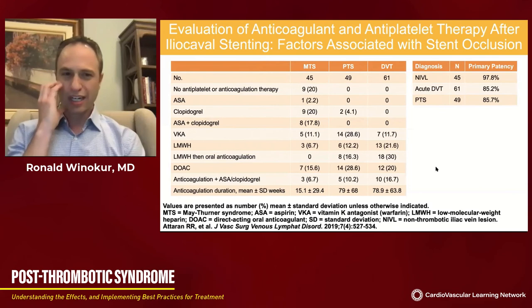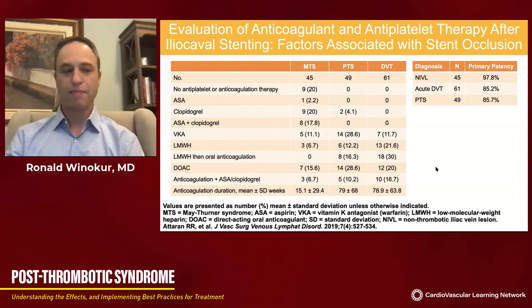Let's look at another study. So here's an evaluation of anticoagulants and antiplatelet agents. This is a mixed group of patients. So these are all the ileocaval stent patients that were treated between 2013 and 2017 at Yale. And to note that these are all patients treated with wall stents and treated by 17 different operators.